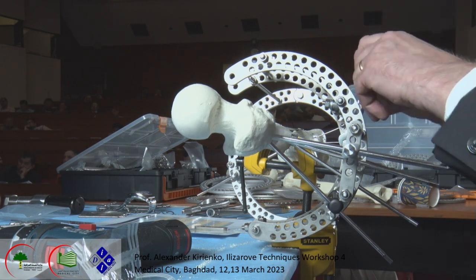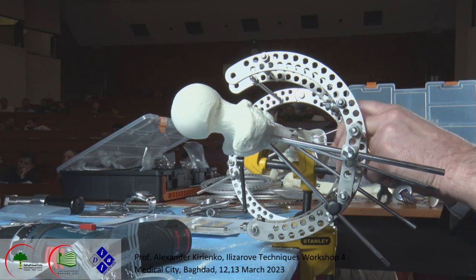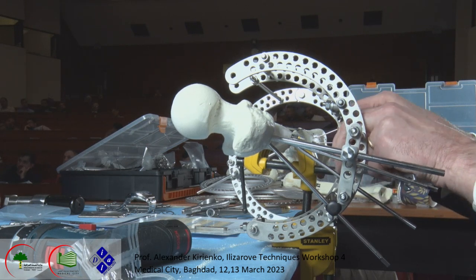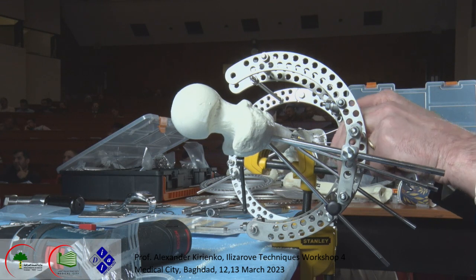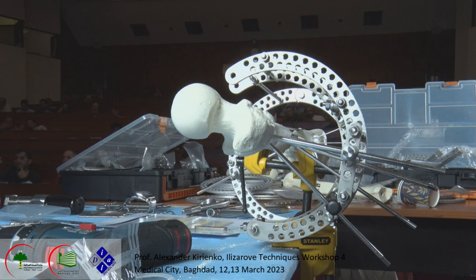Because it's not only the bones, we should always think about muscles and about the tension of the muscles and the fragment displacement. Because if you put all straight, it looks like a nice frame, but it's not functional.